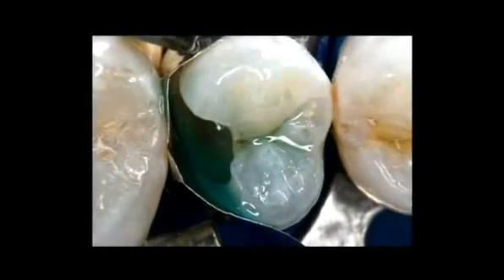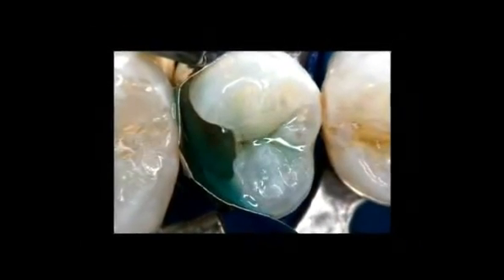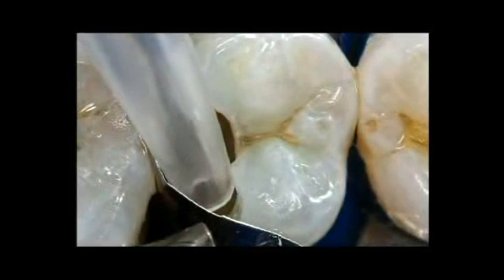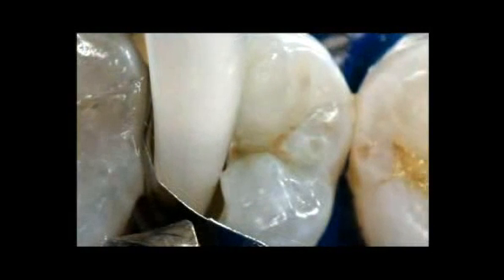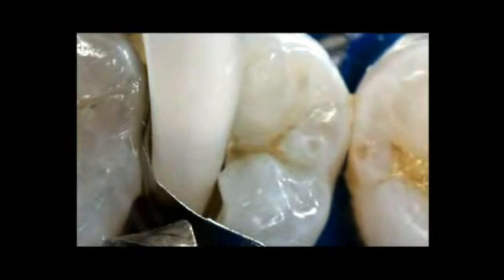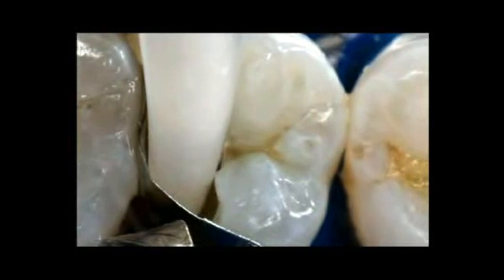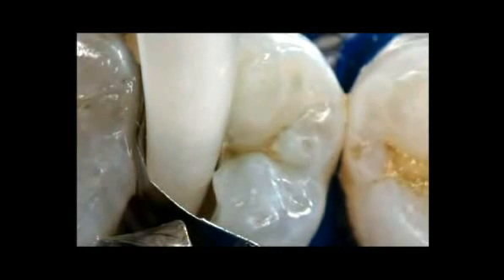GC cavity conditioner is applied to the entire cavity surface for 10 seconds using a microbrush and rinsed thoroughly. A glass ionomer cement restorative, Fuji IX GP Extra, is injected into the cavity preparation. It is important to place the tip to the base of the proximal box and inject slowly while removing the tip slowly. This technique prevents incorporation of voids.